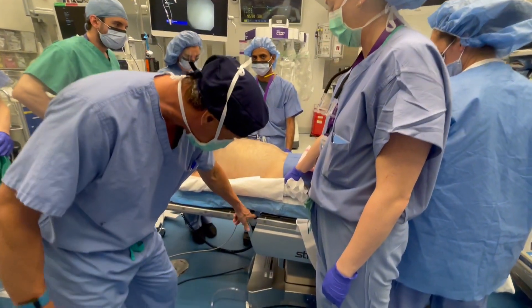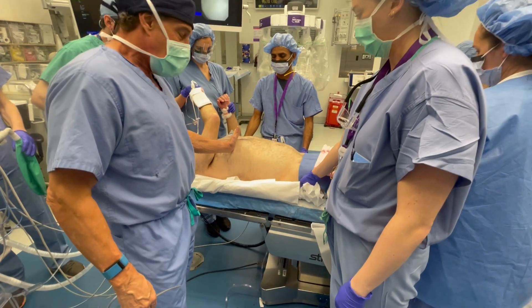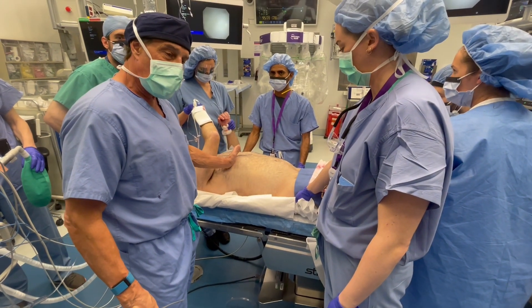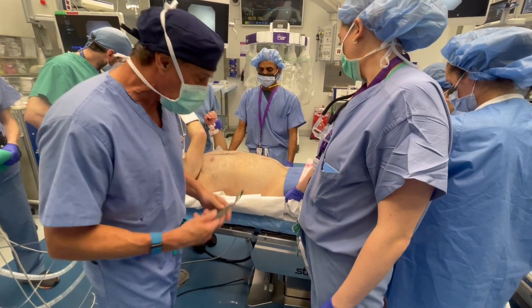Two, you find the break in the table, which is here. That break needs to be over the 8th and 9th rib, because that's where you're going for a robot. For VATS, it's over the 7th. For thoracotomy, it's over the 6th. So he has to come down to the break.